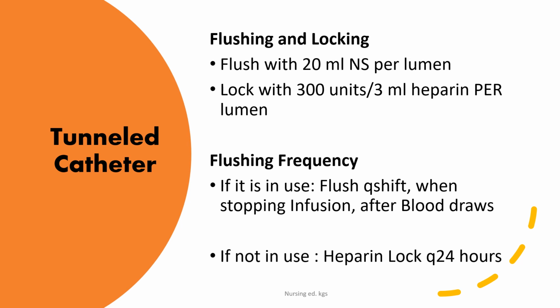And if any of these occur, then you need to notify the physician and not use the catheter. Additionally, you have to ensure that any de-accessed lumen is flushed per policy, and always use turbulent flushing and positive pressure when you are flushing.